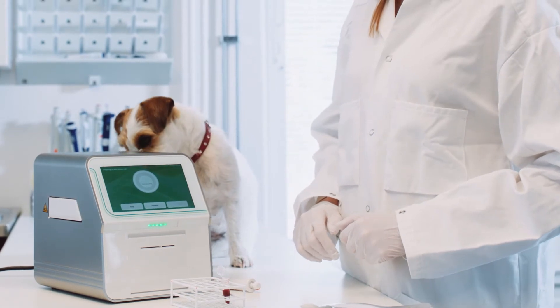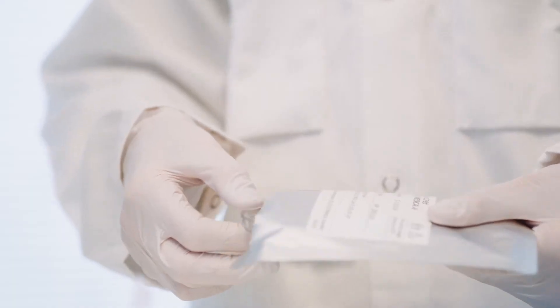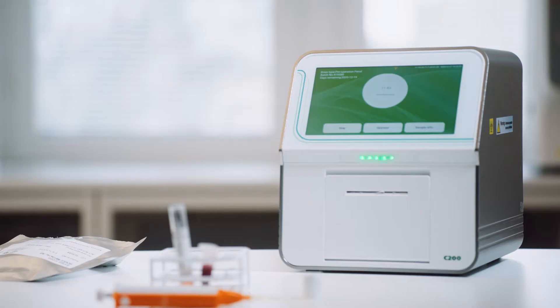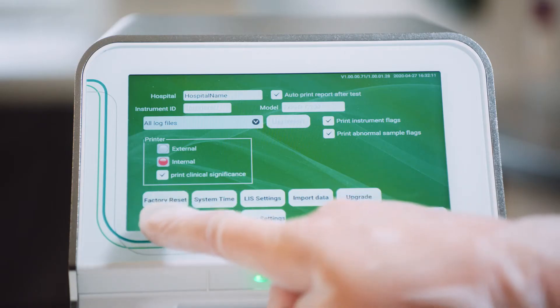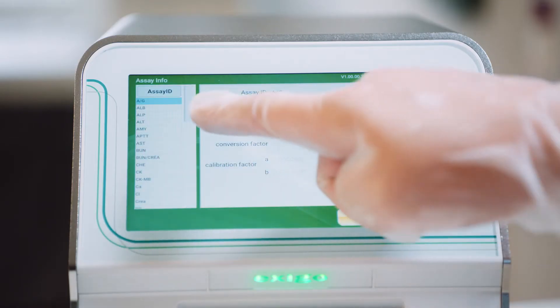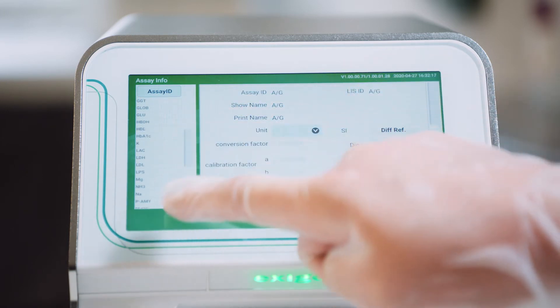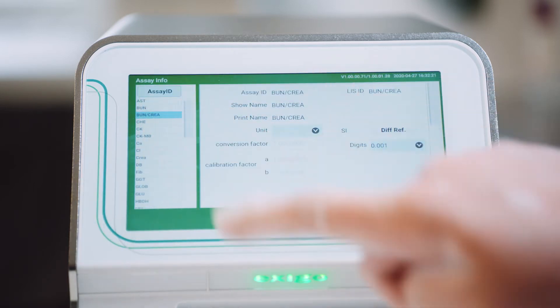Exegos C200 offers different rotors for analysis depending on the parameters to be analyzed, allowing the veterinarians to efficiently combine several parameters in one analysis. The C200 flexibly offers and combines various testing principles of absorption spectroscopy, transmission turbidimetry, and endpoint, rate, or fixed-time testing methods.